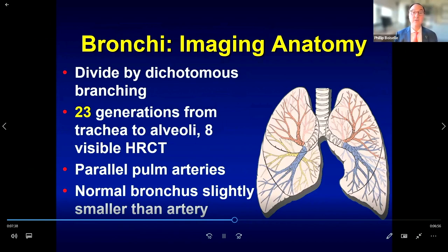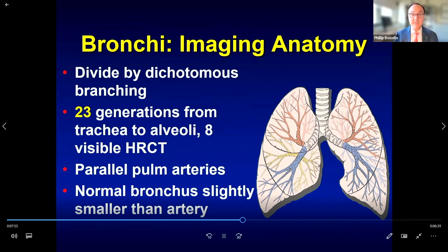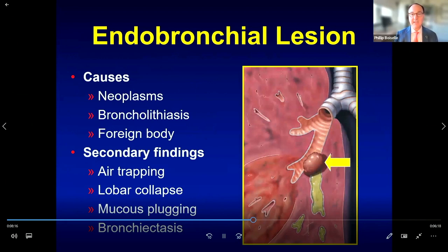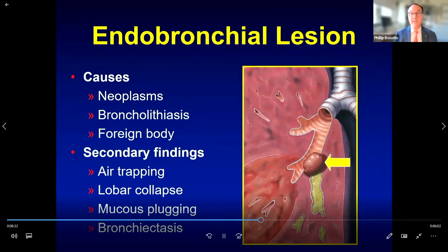Let's now transition to the bronchi, starting with normal anatomy. The bronchi divide by dichotomous branching — 23 generations from the trachea to the alveoli, about eight of which are visible on thin-section CT. The bronchi run parallel to the pulmonary arteries and are approximately the same size. An important finding to look for is endoluminal lesions from neoplasms, broncholithiasis, or foreign bodies. Sometimes the most dramatic findings are secondary: post-obstructive air trapping, lobar collapse, mucus plugging, or bronchiectasis.